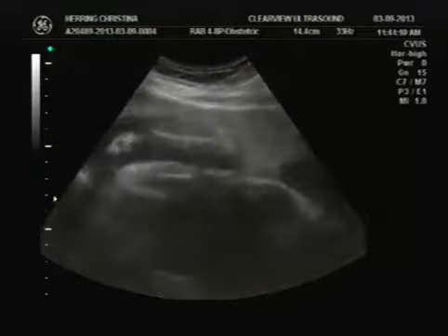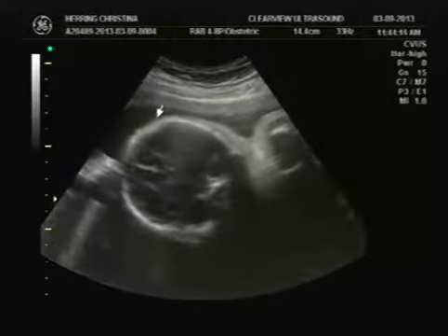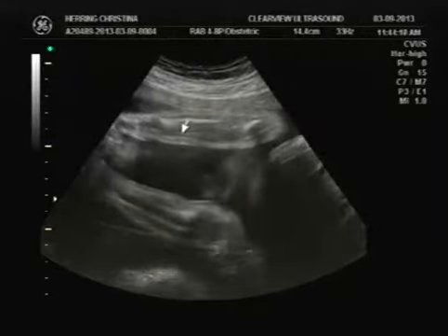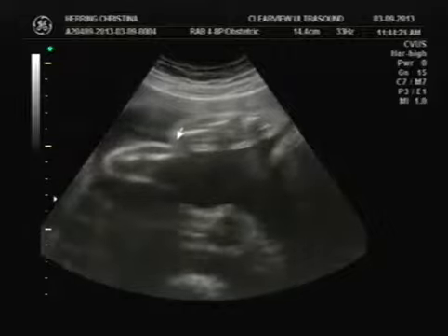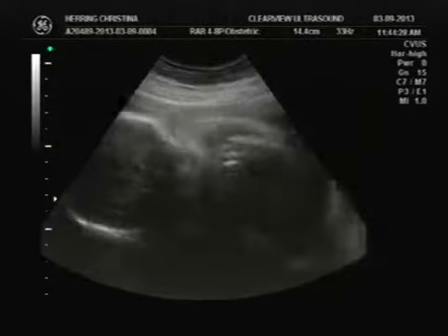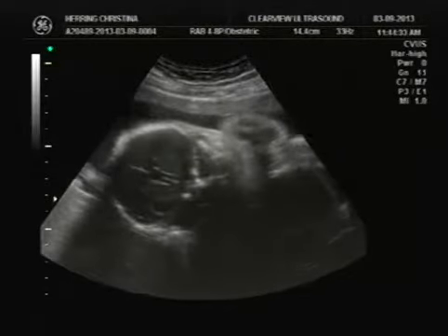Sideways, and she's folded in half because here in this picture, this is of course her head, and then we come to her hands in front of her face, and then we have her legs. So she's got her legs in her face, and she's laying all like a taco sideways. She's so silly. Baby girl, you got to do some things so we can see you better. Here, let's see.